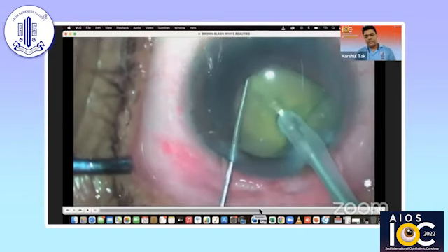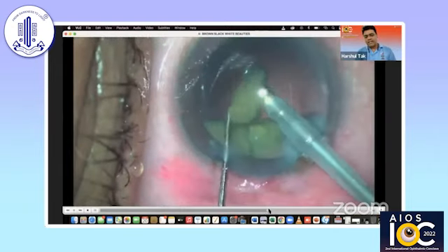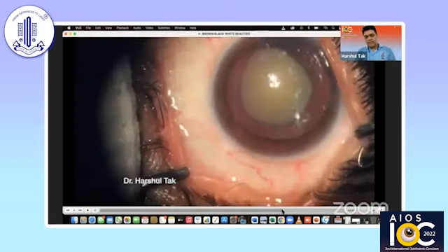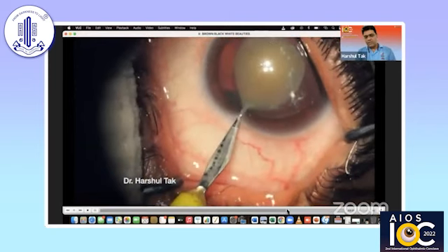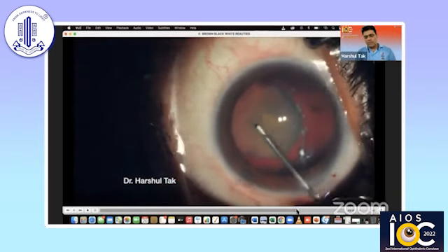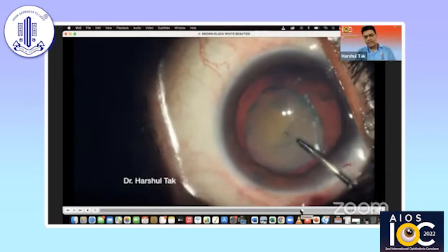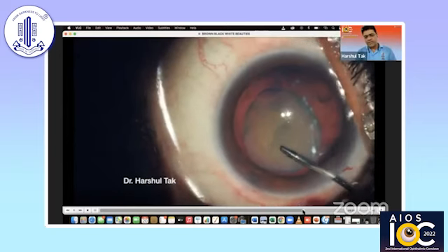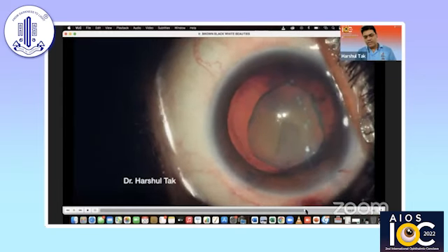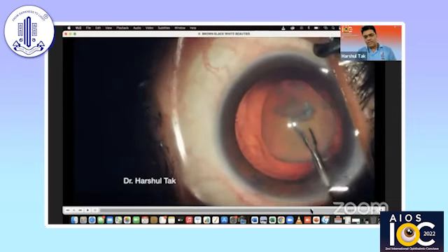The technique which works best is to go with bevel down, hold the nucleus and come in from horizontal chopping from the equator. Again, hold the nucleus, bring it up towards you and chop it from the equator. This way you can easily crack these mobile nuclei. The Morgagnian cataract has almost no cortical matter — just a small nucleus. I'm making the capsulorrhexis; when I reach this area, I rotate the nucleus to get a good view of the capsulorrhexis propagating. The capsule has been stained here. You need to improvise many times depending on the situation.